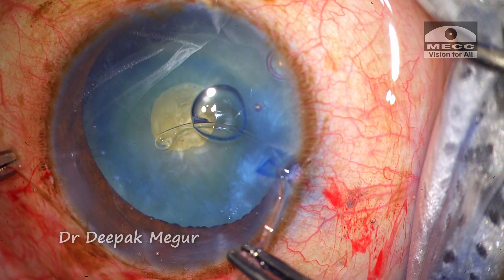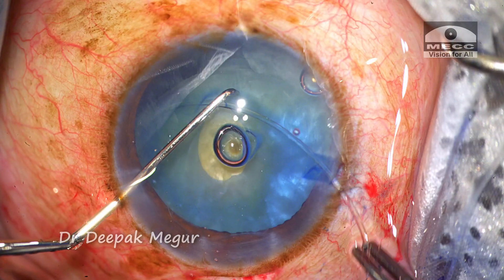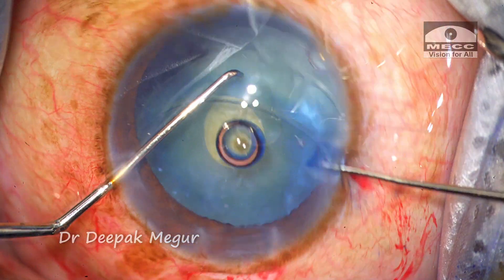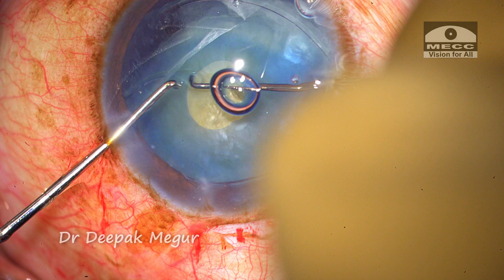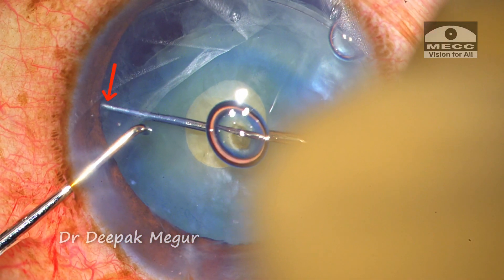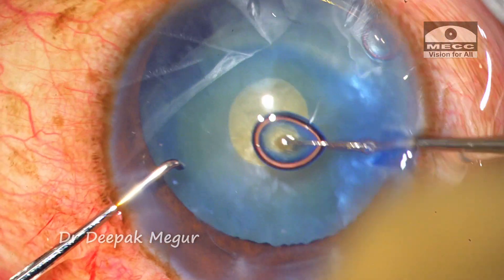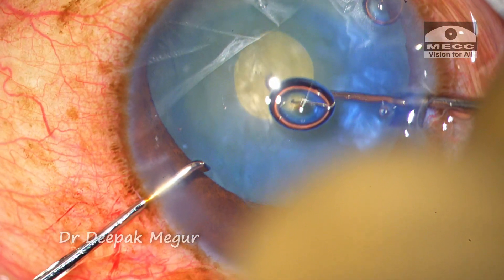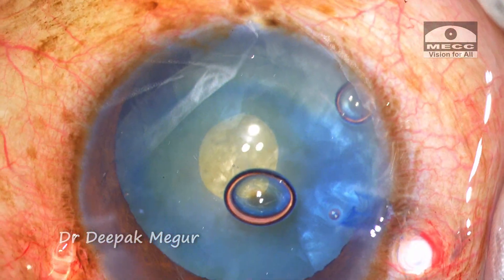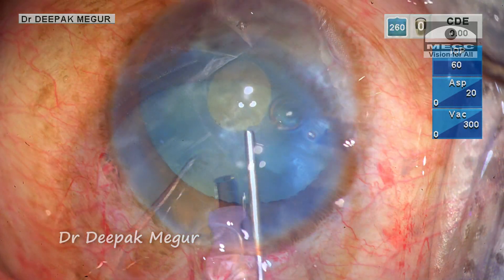It's a little tricky to insert the CTR into the small opening. However, compressing the CTR with the second hook minimizes the stretch on the rhexis margin and also reduces the stress on the zonules. I dial the CTR to ensure that the entire area of zonular weakness is well supported by the ring. The lens tilt which was initially seen is now not very obvious — the CTR support is working well.